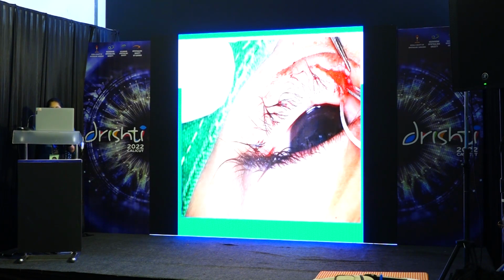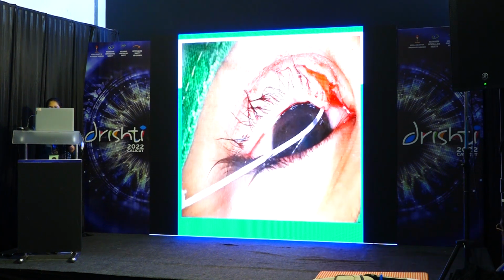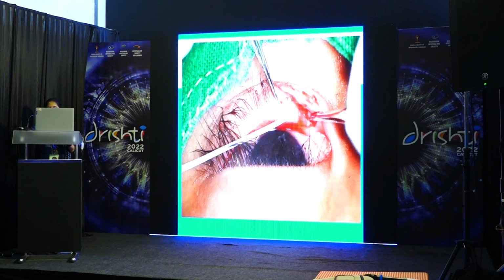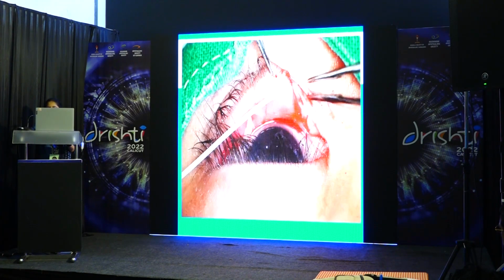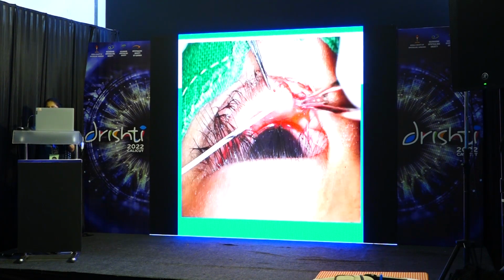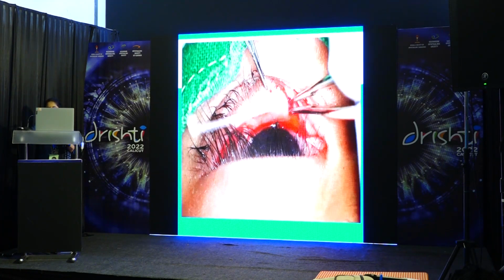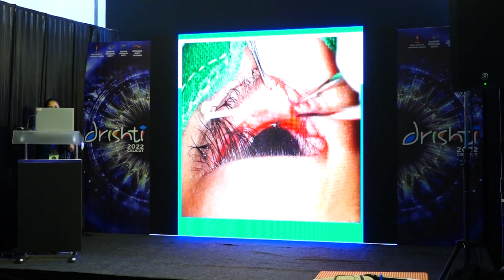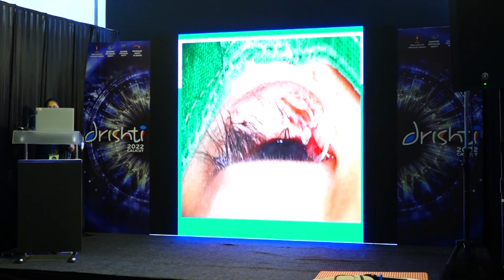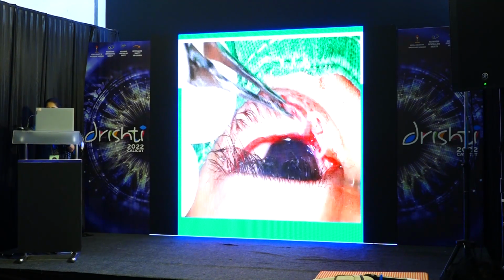And I'm going to fast forward this a little bit. Okay, so once this is done, this stent has got a longer tube and a collarette which sits in the punctum. So that can easily give you, almost you don't have to suture the end also. It is just that you insert this and look at this, the collarette sits next to the punctum. So for the insertion, you can use either a probe to insert into the punctum or sometimes you can just pull from the distal end.